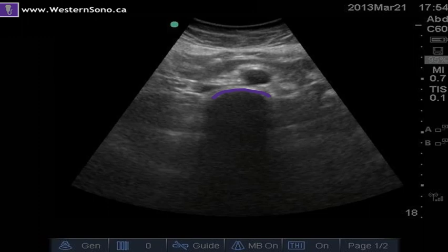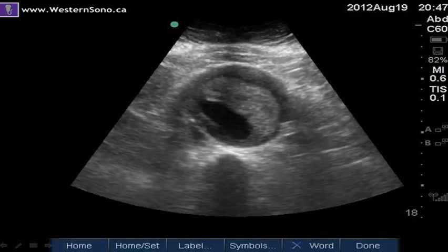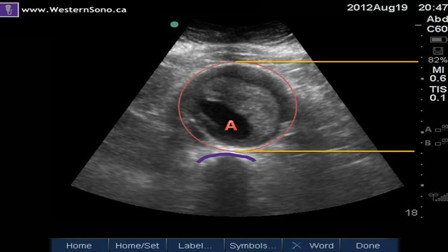Now this scan represents a normal aorta, but if you were to come across this image in a symptomatic patient, then this might be a real game changer. We still see the vertebral body and the acoustic shadow behind it, and the aorta is fairly evident. However, when we carefully look at the white outer echogenic walls, we clearly identify a more significant diameter. By counting the hash marks on the side of the screen, a quick estimate reveals that this aorta is upwards of 8 centimeters.